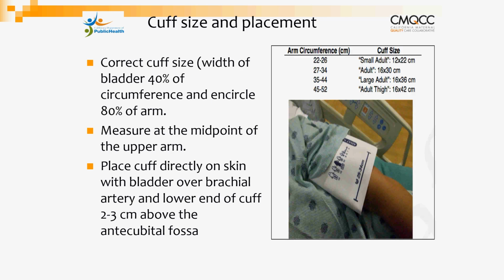And again, we're going back to rudimentary, but this is something that is really important to share with the staff, particularly when we are starting this initiative, and also for monitoring compliance. We want to make sure that staff are following best practice and are using the right size cuffs. It's easy sometimes if you've got them already in your drawers or in storage, or they've been ordered, and that's the only thing that you've got available, that staff may decide to use that. But it's really important, as you can see from the graphic, that the arm circumference will really dictate the size of cuff that's needed.